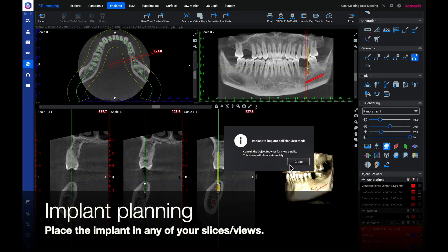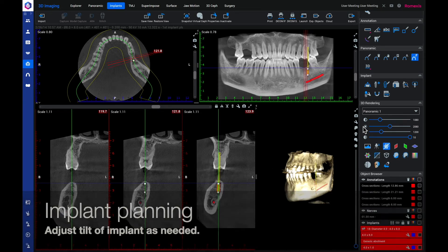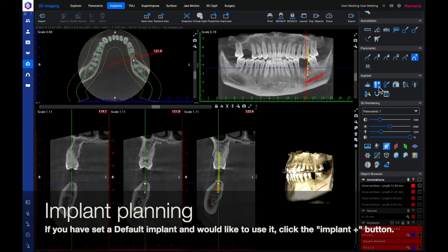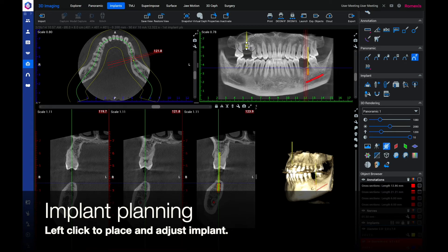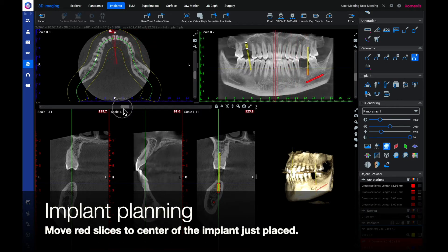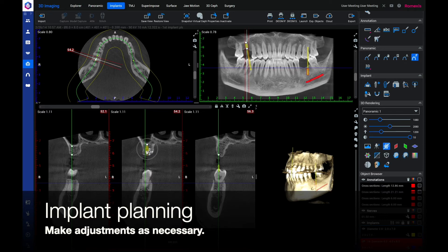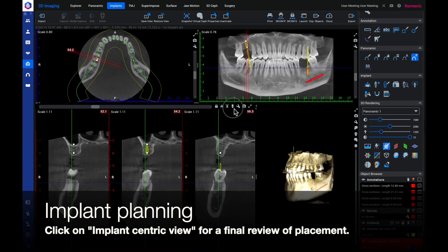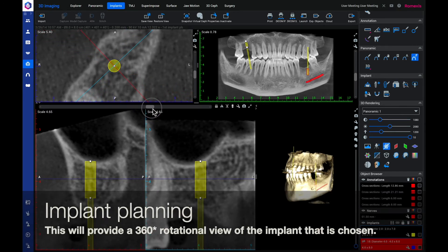Place the implant in any of your slices or views and adjust the tilt of the implant as needed. If you have a default implant set and would like to use it, click on the implant with the plus symbol. Left click to place and adjust the implant like before. Move the red slices to the center of the implant just placed and make adjustments as necessary. Click on the implant-centric view for a final review of placement — this will provide a 360 degree rotational view of the implant you have chosen.